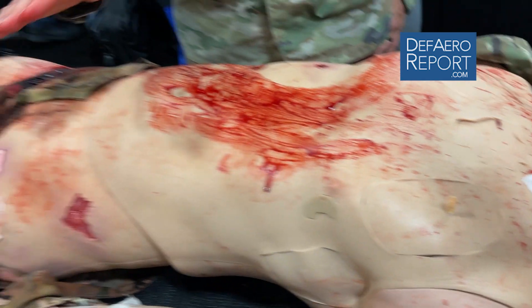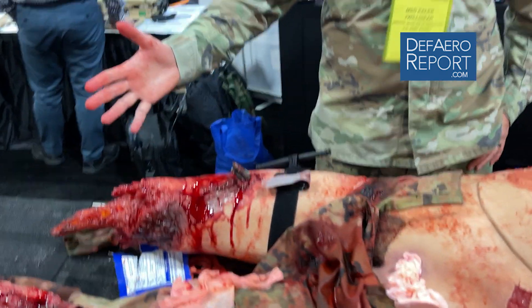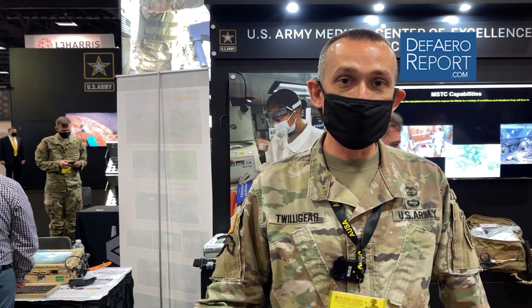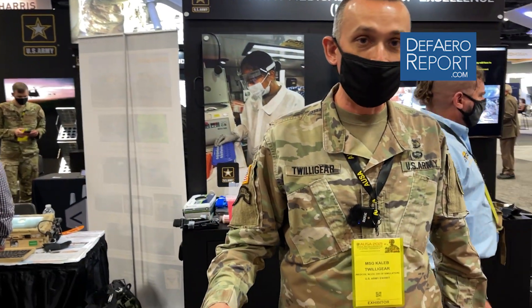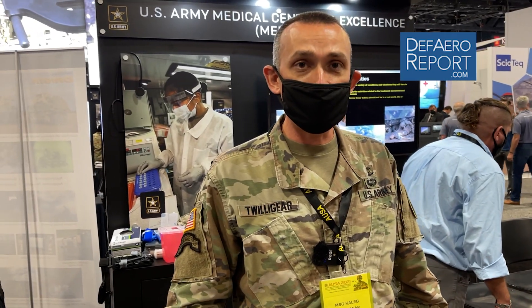Again, this is for medics to incorporate into unit collective training so that units as a whole are able to deal with all these injuries. As rough as this patient is, this patient is survivable, and if the right things are done at the right time, this patient will be back to duty leading PT in 18 months.